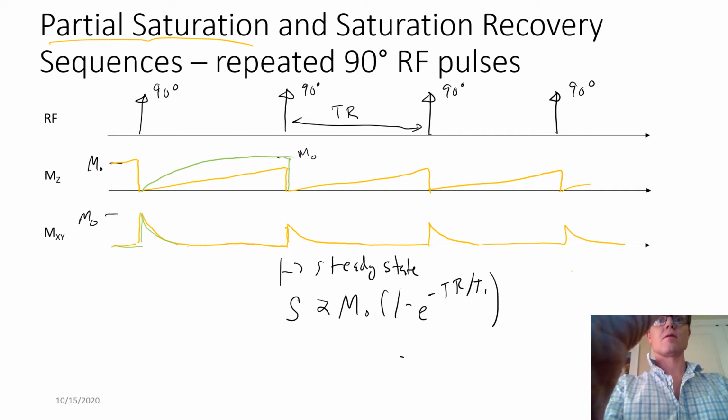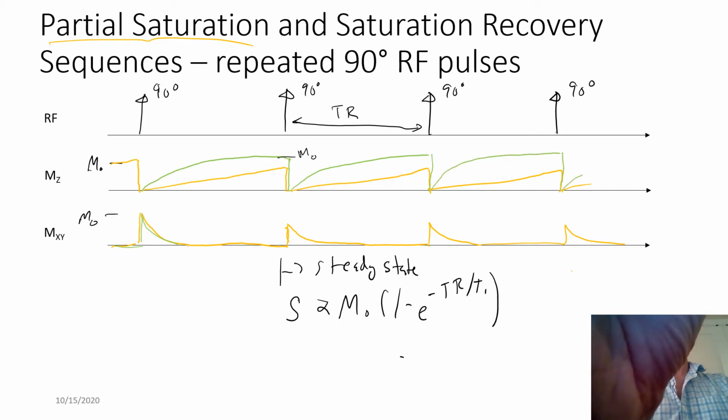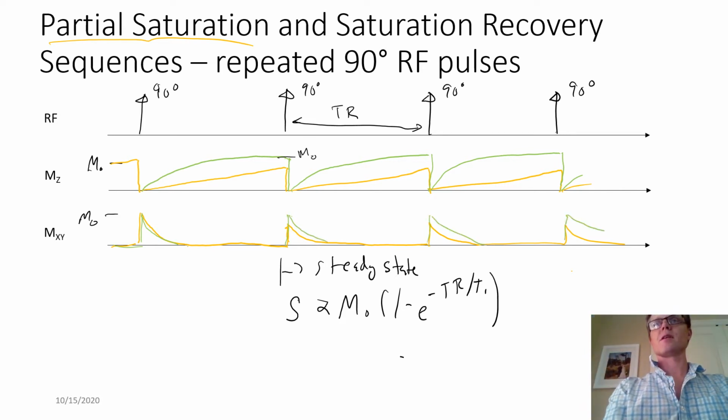Then again, we have the same repeated pattern here. This time we'll have slightly higher transverse magnetization, higher signal, and this is what is referred to as saturation recovery.